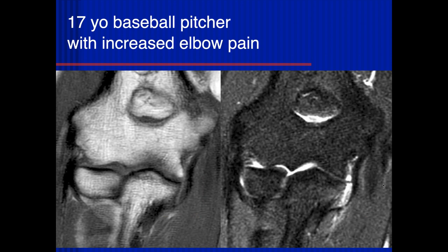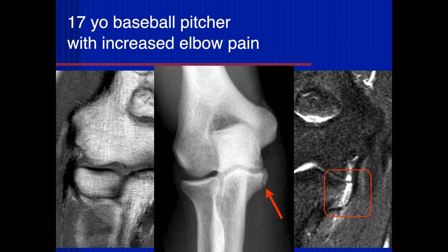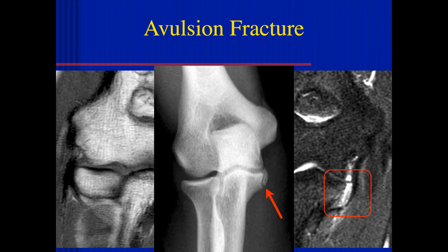17-year-old baseball pitcher with increasing elbow pain. Here we can see some marrow edema within the sublime tubercle at the attachment of the ulnar collateral ligament anterior bundle. It looks like a non-displaced osseous avulsion injury. So if you don't heed the warning signs of stress reactions, you can go on to a fracture.